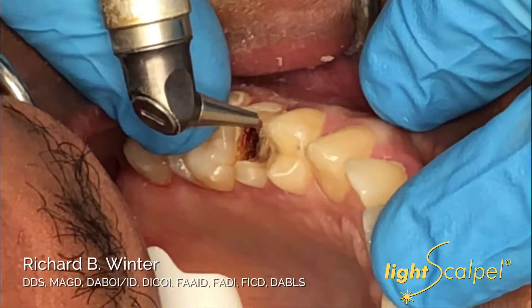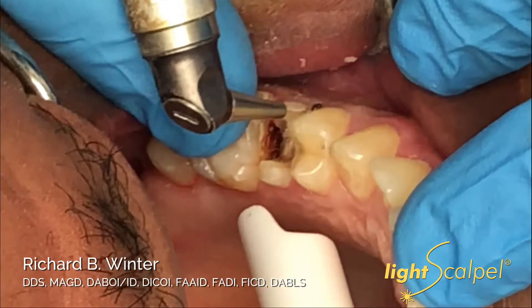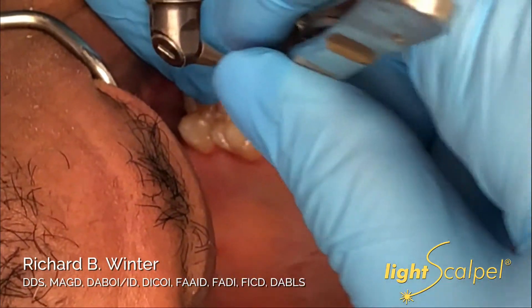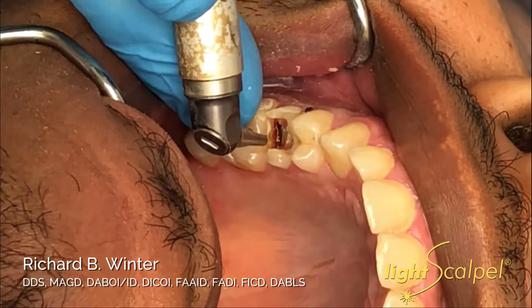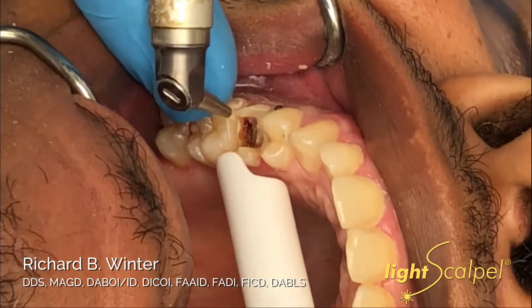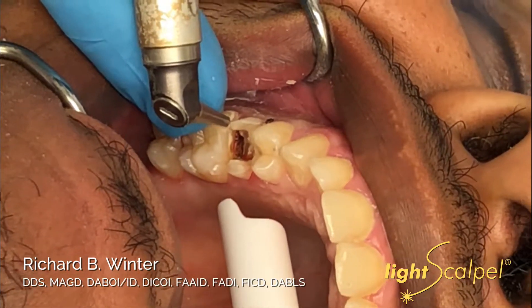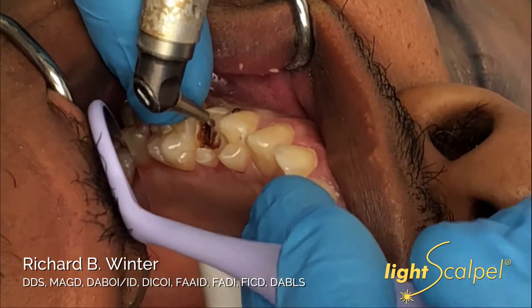We'll carry that around to the corner of the tooth, then take a wet cotton pellet and remove the char a little bit. She's just scrubbing that away. We'll be able to put it on hemostasis mode and blend it in a little bit later. By not putting it on super pulse, we're getting some really nice hemostasis as we're doing this.